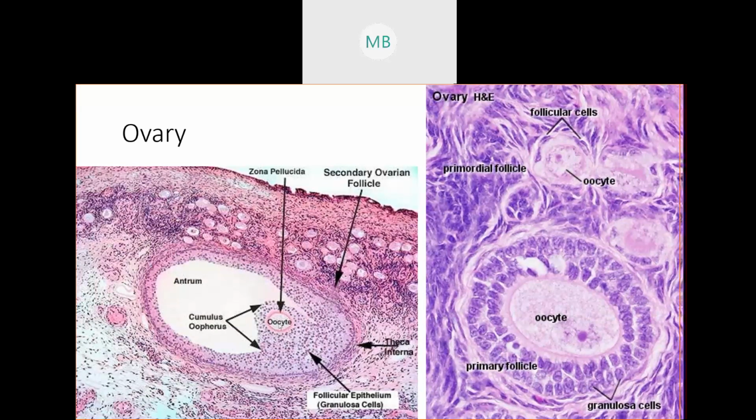And the oocyte in the middle, with all of these other smaller eggs that have not developed yet off to the side waiting for their turn. So once again, over on this side, you have oocytes right around here. Oocyte is your fancy word for egg. And then you have the chosen one, the oocyte here with its space around it and the body building its nice little protective cluster and wall around it. You will easily be able to see eggs and one super deeply developed egg on your slides of an ovary, if you are shown an ovarian slide. And that should be all, my lovelies.